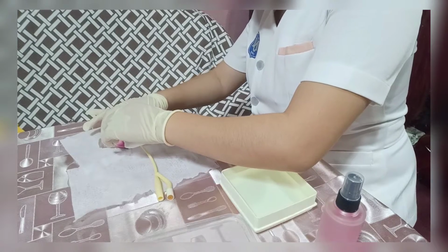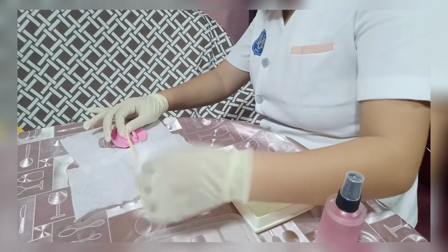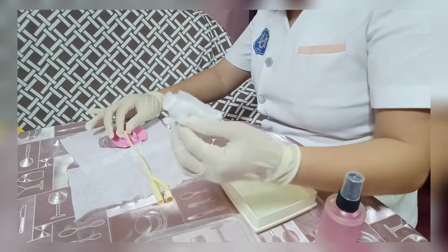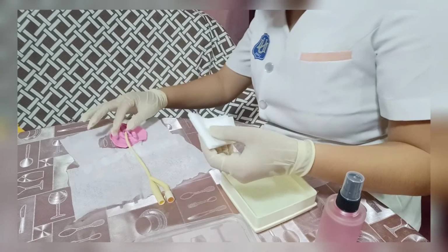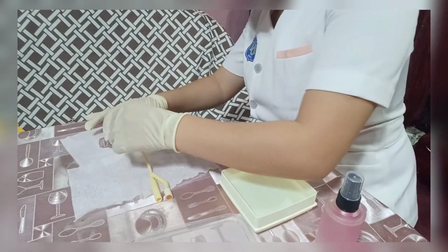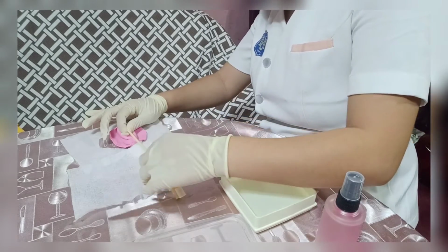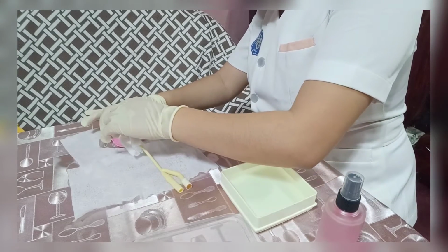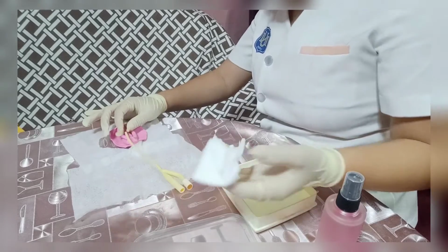Use the clean cloth, one direction to another. Repeat it again. Clean away from the meatus, then again, one direction each stroke.